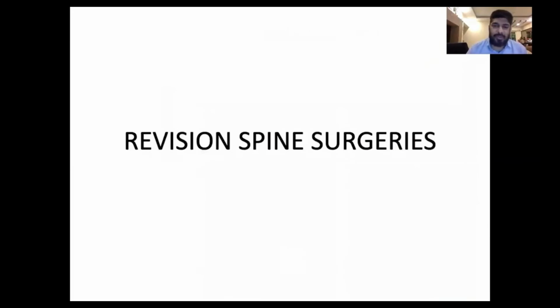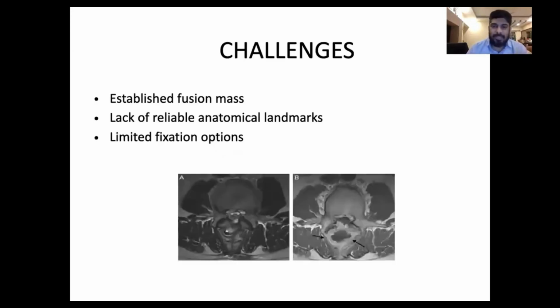Revision spine, big advantage of O-arm navigation because you can plan your revision screw, you can plan your decompression, also the bony mass, the screws or implants inserted previously. We can actually have a better anatomical understanding on table, and this is a big advantage.